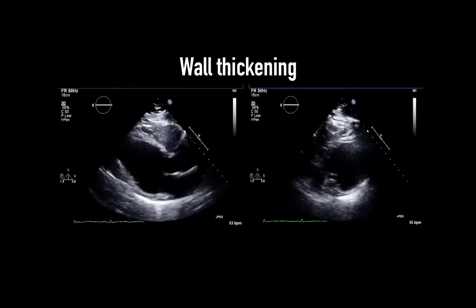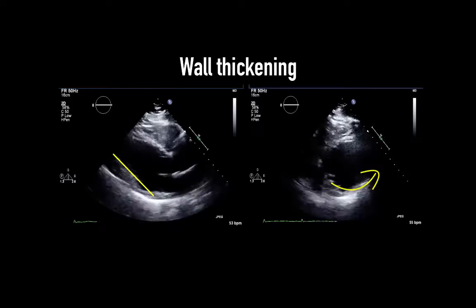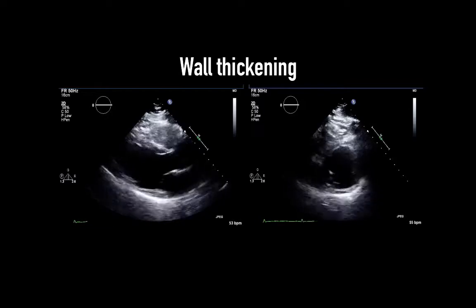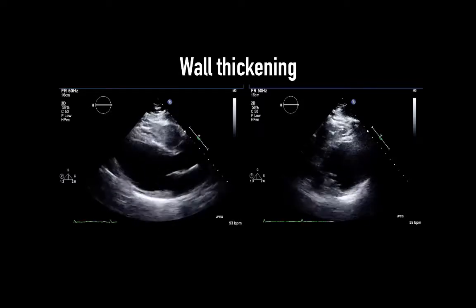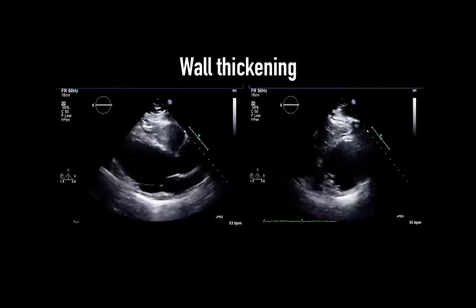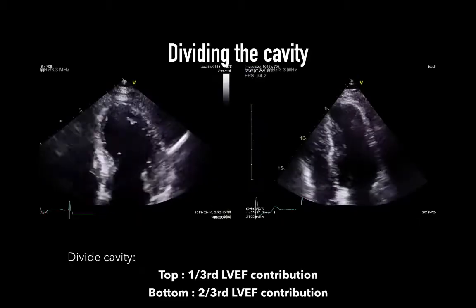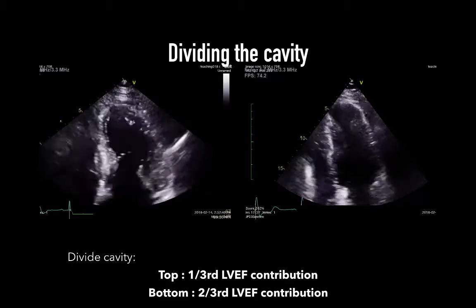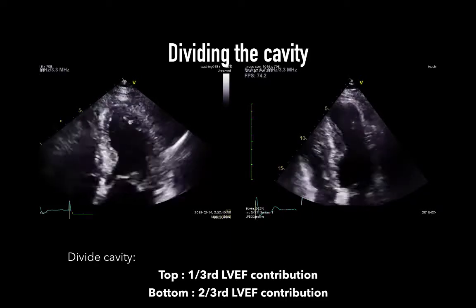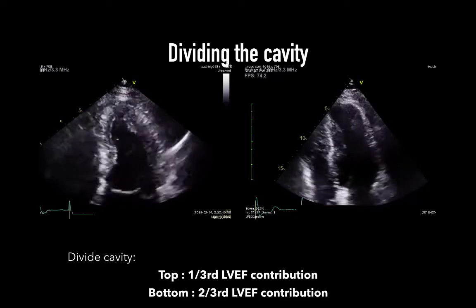In these clips, note the difference between an akinetic wall in the inferior and infralateral regions and normal wall contraction in the other segments. The cavity still decreases in total volume as the contracting walls converge towards the middle. The akinetic wall remains relatively fixed but does not move away during contraction. Remember that these cavities are bullet-shaped, so not every region contributes equally to volume ejection — in the basal segment, even a slightly larger diameter means the volume is cubed.